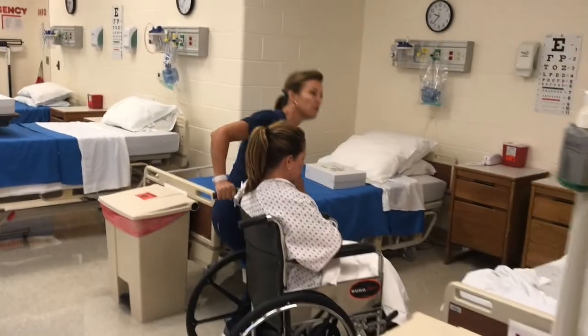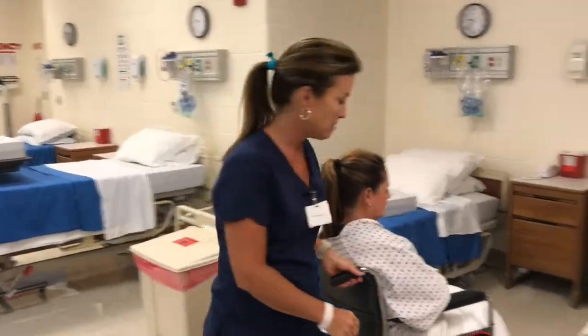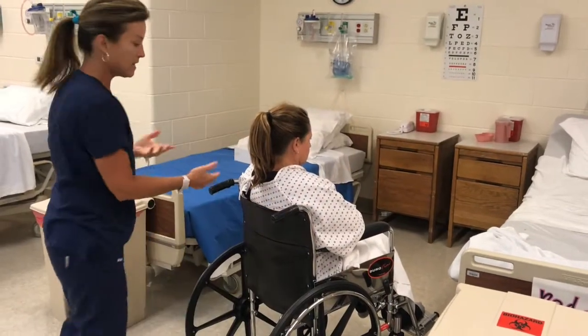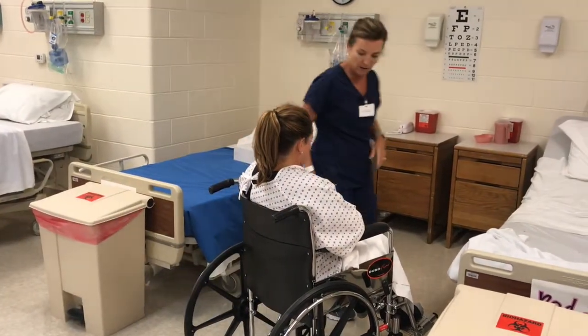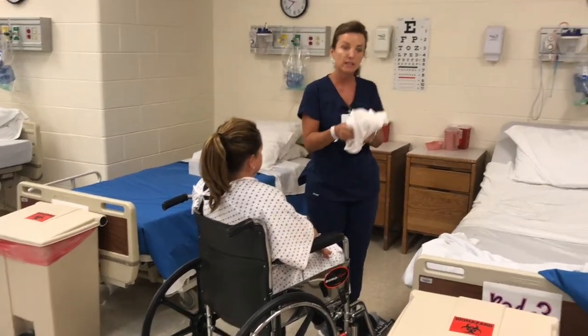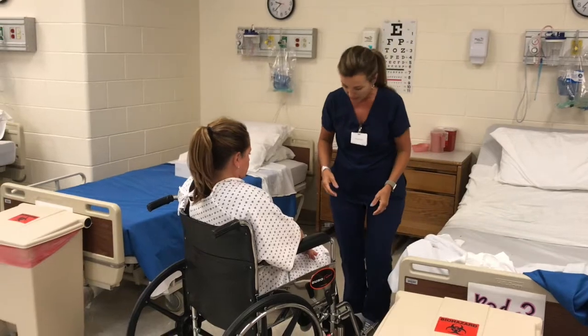It's very important that you lock your wheelchair so the patient doesn't roll when they stand up. Come around, get your soiled supplies, and we're going to dispose of this in the dirty linen.